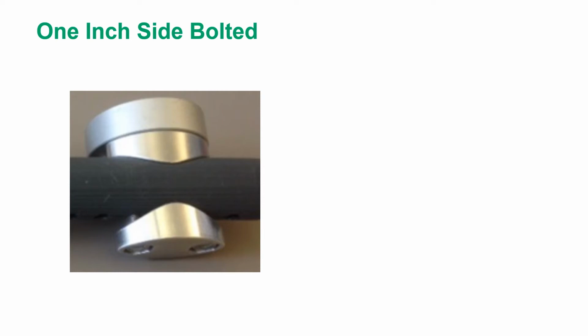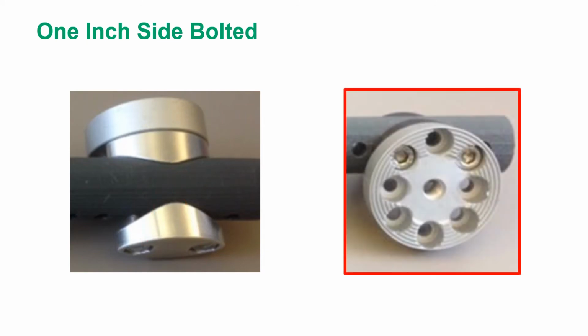Similar to the 1-inch side frame clamp, it does not encircle the wheelchair frame. So, it can be used where other wheelchair parts do not provide adequate clearance. There are 2 bolts that fit through the wheelchair frame's bolt holes. They connect the wheelchair tube fastener and the inner piece to the wheelchair. You might choose this frame clamp if you need stability for a heavier device. You have the holes in the wheelchair frame, but you don't have the clearance for a 1-inch round frame clamp.